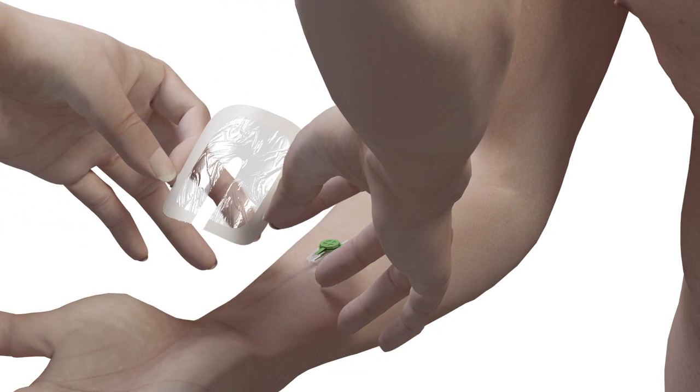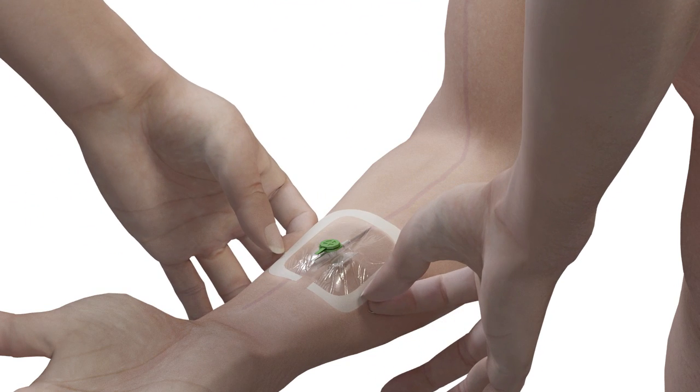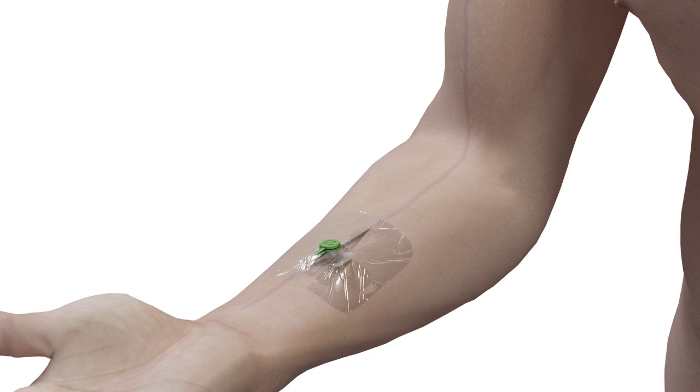After cannulation is achieved and any blood samples taken, the quick-release mechanism allows single-handed removal of the disposable vacuoderm tourniquet. Dressing is then applied to complete the cannulation process.